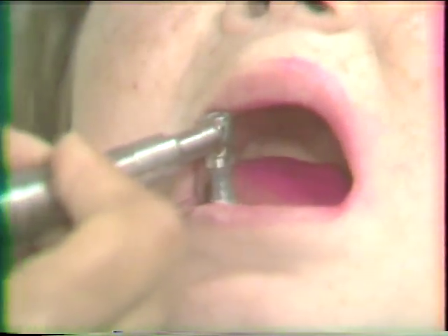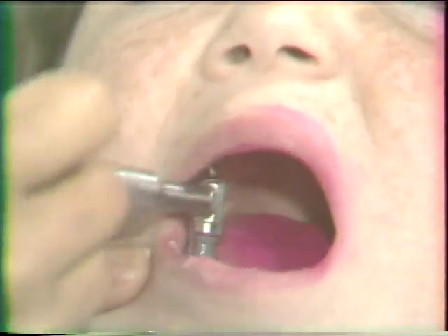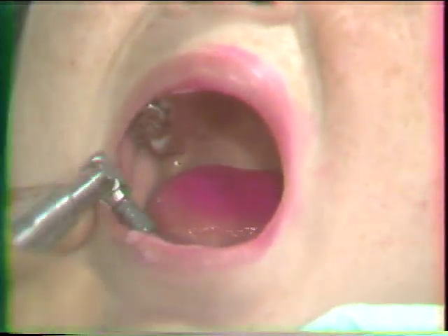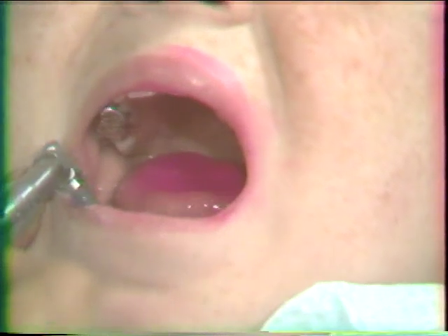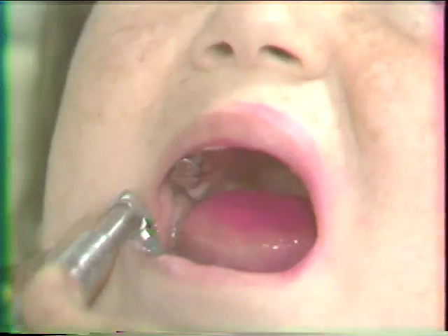Having placed the prophy angle accurately, you should now rotate the cup mesial-distally as you move toward the buccal incisal surface. Then proceed to cleanse the occlusal surface. Finally, moving to the lingual surface, cleanse the lingual gingival sulcus last. Make sure that you do not overlook cleaning the interproximal embrasures.